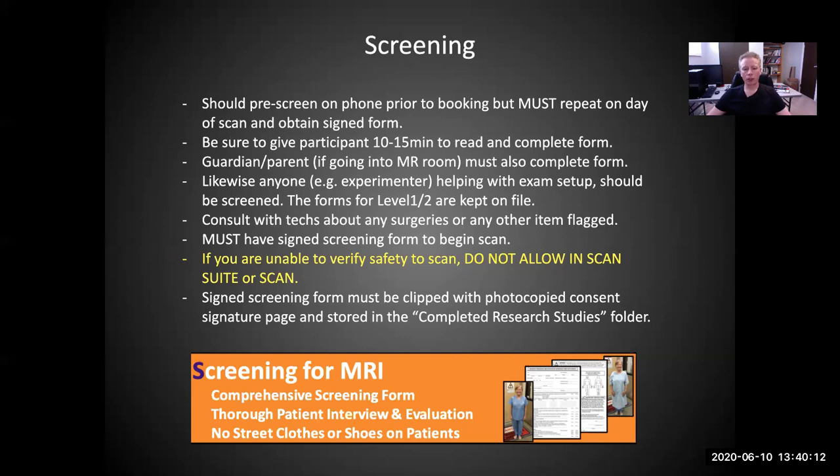And in the case of children, oftentimes it's the guardian or parent that is doing this, and they may be feeling some time pressure from their job, etc., which would make them less likely to read it and think about it carefully. Another reason that we want to go over it carefully is that we have to realize that there is some medical terminology on the screening form, and some people will be inclined to skip over it instead of asking questions about things they don't understand. And so we have to elicit responses as well as just simply handing them a form.